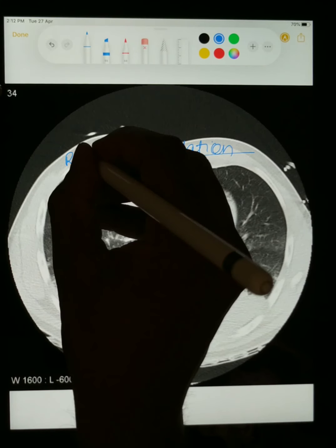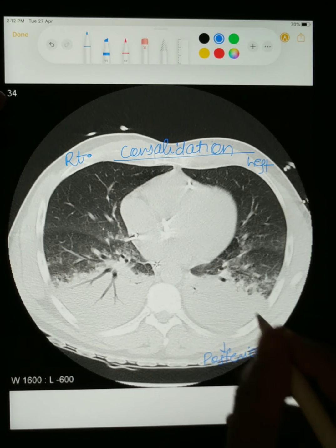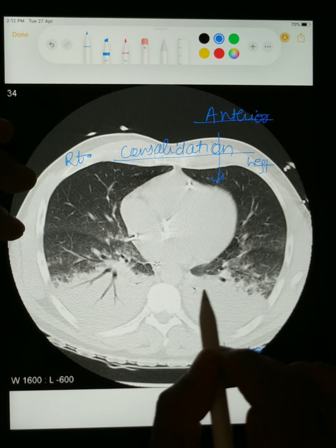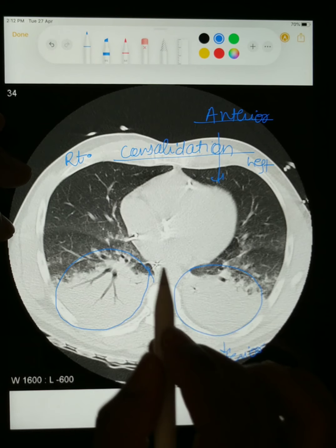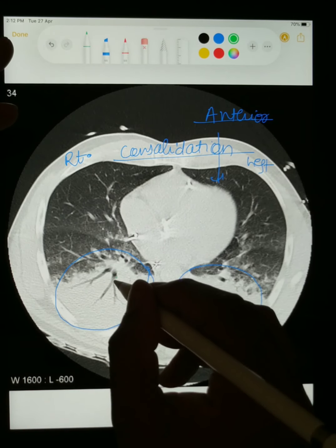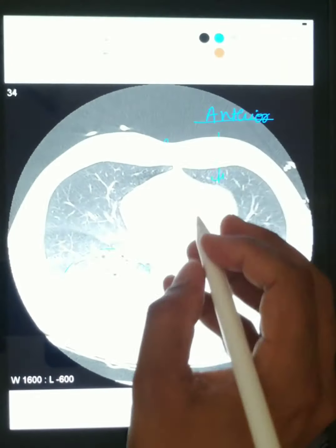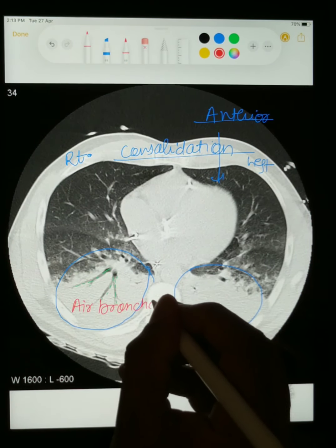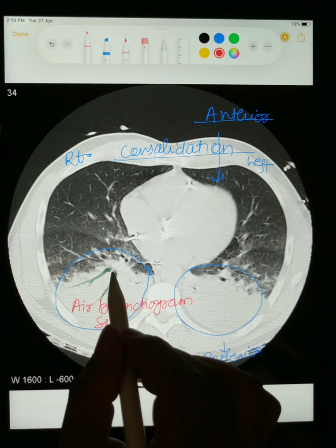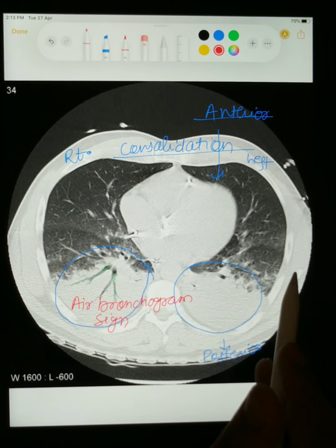This is the CT chest of the patient. On CT, this one is the right side, and this one is the left side. This is the posterior part of the lung and here is the anterior part. Consolidation is an area of complete white-out of the lung. In consolidation, the lung area is completely white, and the typical finding is these black markings representing air in the bronchioles — this is known as the air bronchogram sign. So in typical consolidation, an area of white lung with air bronchogram sign will be seen. Here the posterior part of the lung is involved with consolidation with air bronchogram sign.